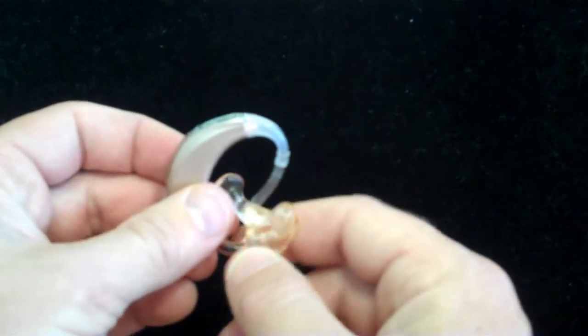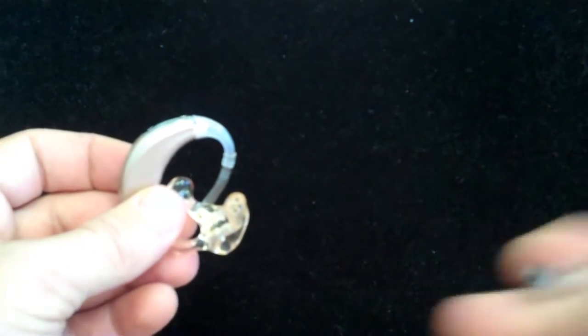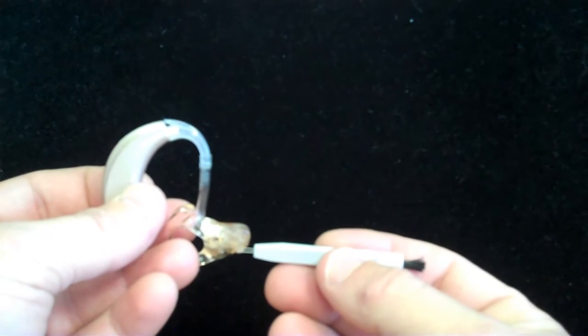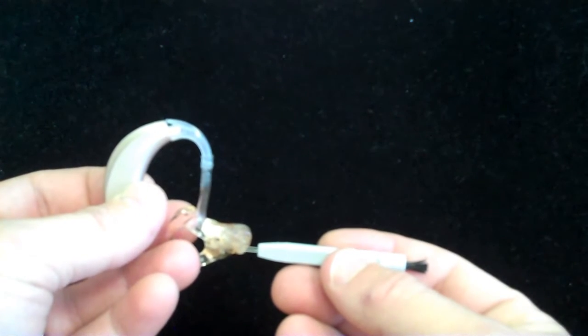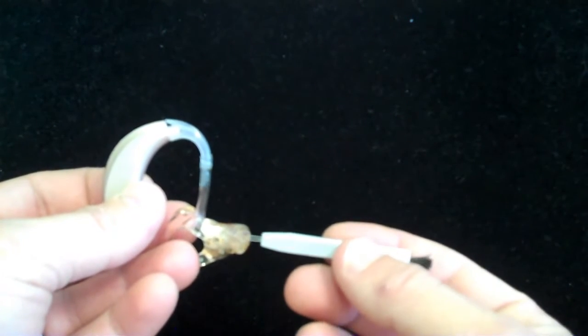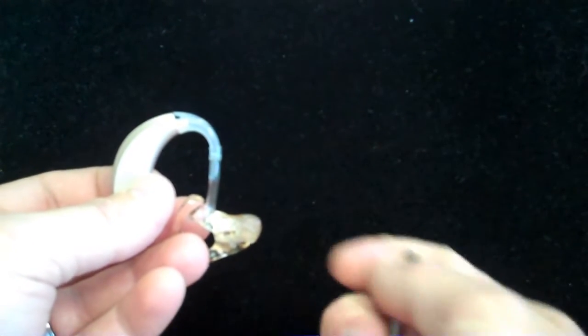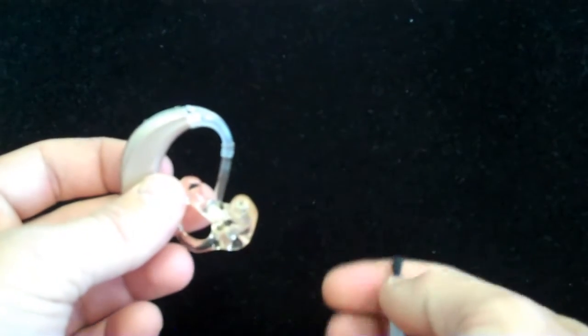In the custom earpieces, typically you're going to have one hole for the sound to pass, a second hole which serves as a pressure ventilation passageway. That way when the ear mold is in your ear, it doesn't literally plug up the ear, it allows air to bypass the earpiece as well.